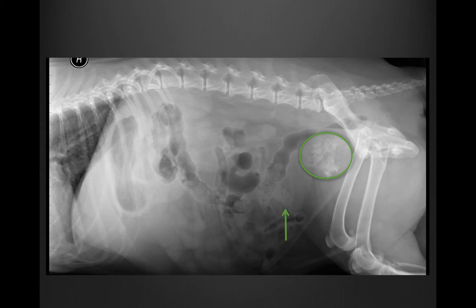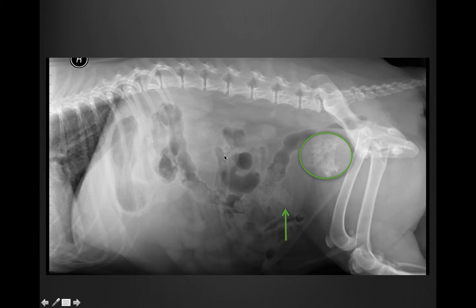Another thing we can get the impression of on this radiograph, despite superimposed bowel, is little mineral foci superimposed over the bladder. With the superimposed bowel, it's not clear whether this is within the bowel or within the bladder. Similarly, you get superimposed mineral over the region of the kidneys, so you should have concern for mineralized bladder and kidney debris.